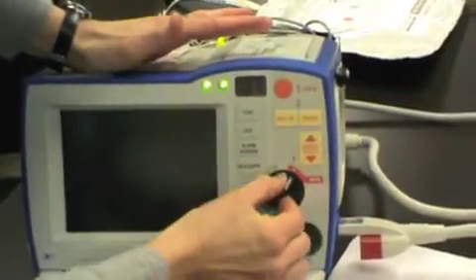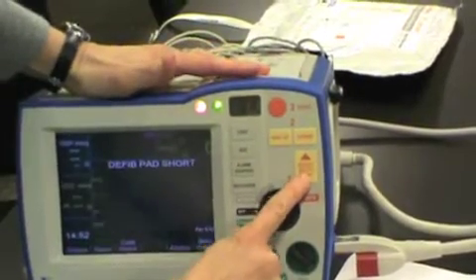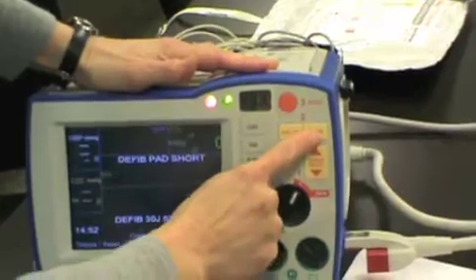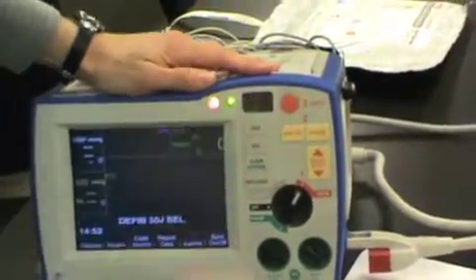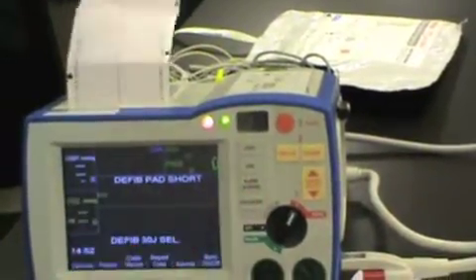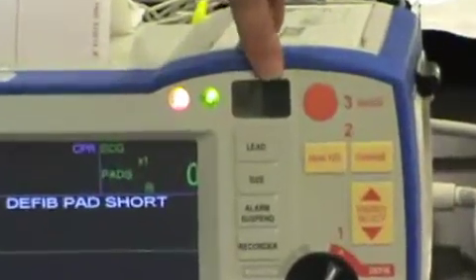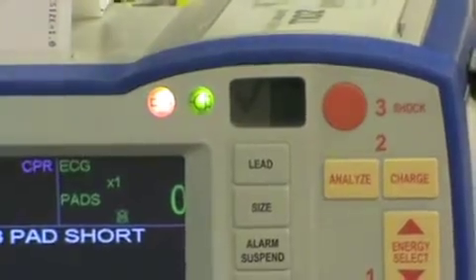So you'll just turn this to defib. We're going to select the energy down to 30 joules, charge, and just shock it right into the machine itself. It started printing, so I'm going to hit recorder to make that stop. And now you can see that my red X has been replaced with a green check. It doesn't light up, it's just there.